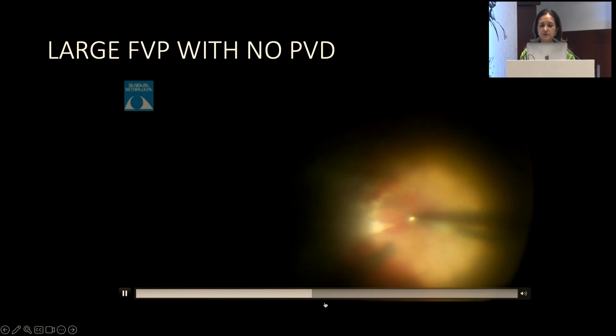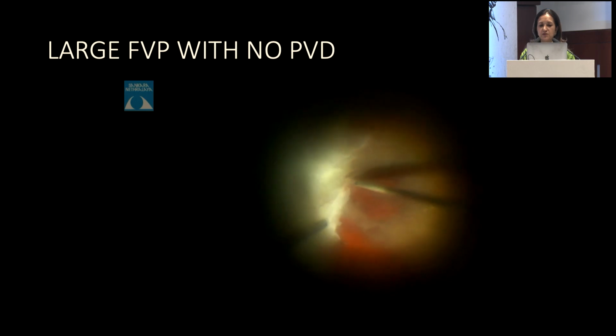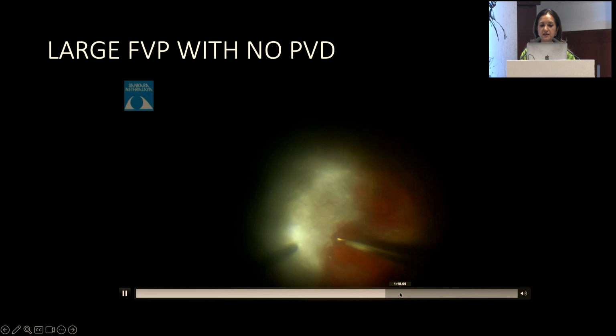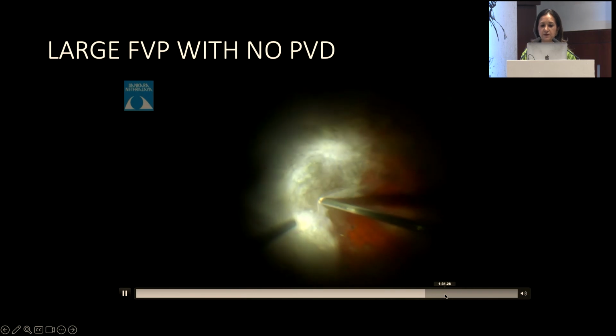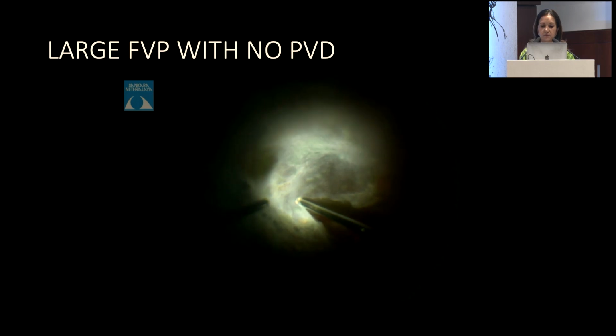Now the story is good. You keep on entering slowly into this area. But because it is stuck, I have to use forceps, the cutter and the scissors to make these inroads and slowly finish the surgery. So identifying where to enter was the most important thing here.